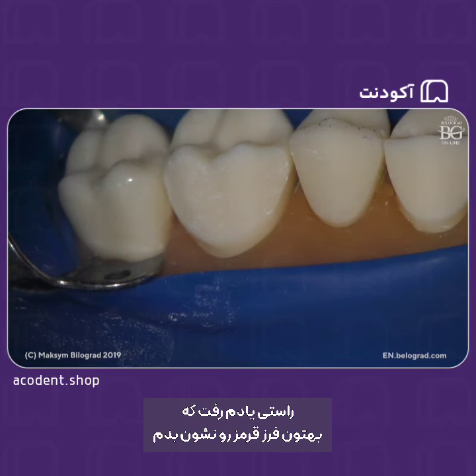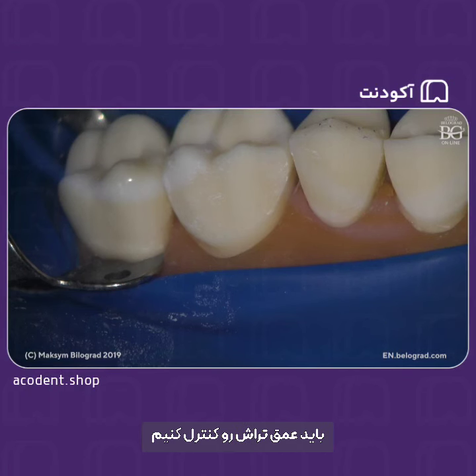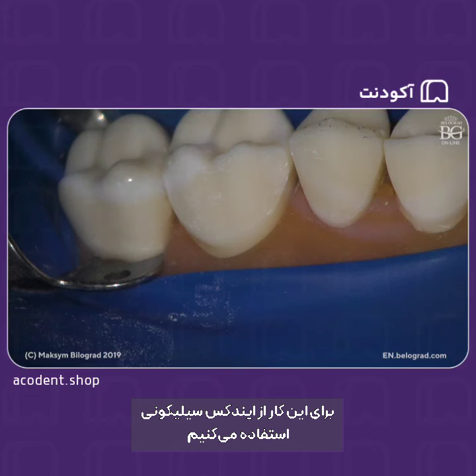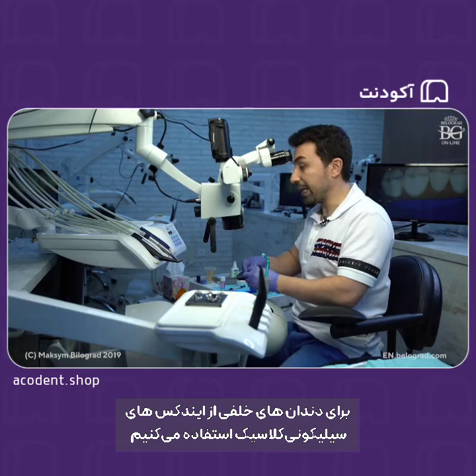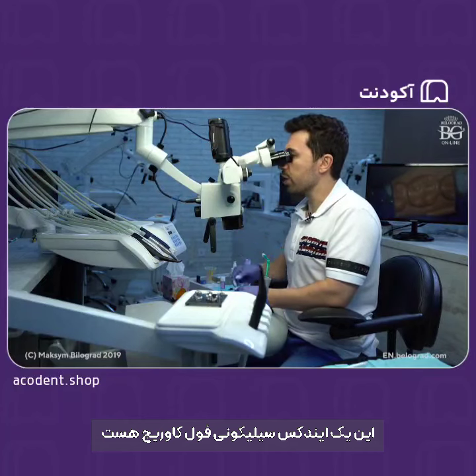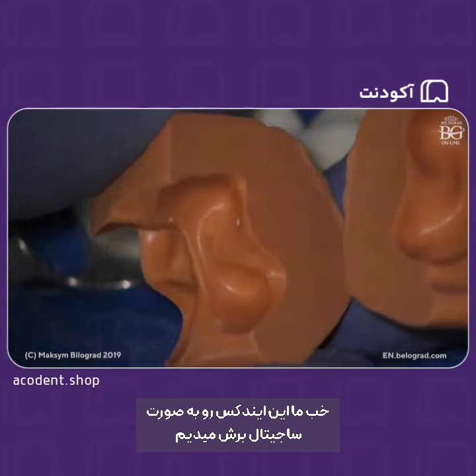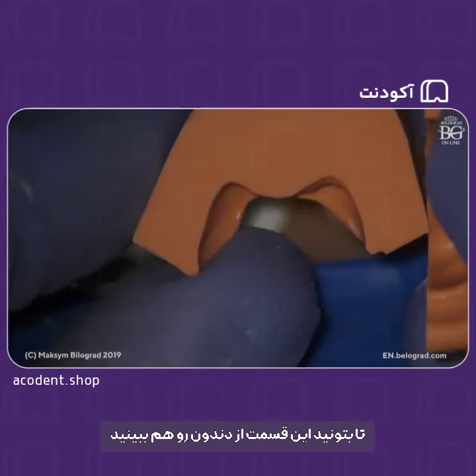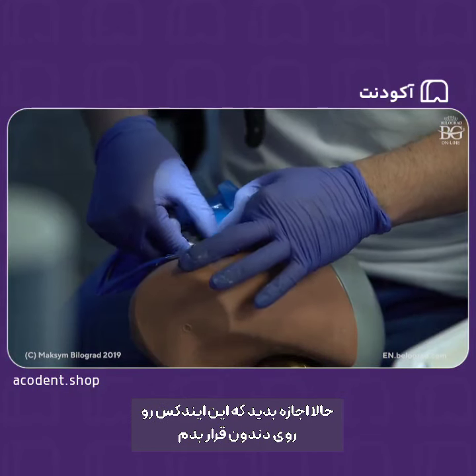By the way, I forgot to show you before the red burr: before the second stage of preparation with the red diamond, I need to control the depth of preparation. Did I prep enough or not enough? For this, we use silicone indexes. For posterior teeth, we use a classic silicone index, as we use for crowns, for example. This is a full coverage silicone index, occlusal, buccal, and lingual. Then we cut the silicone index sagittally, so you will be able to see this part of the tooth. So let me put this silicone index on my preparations.